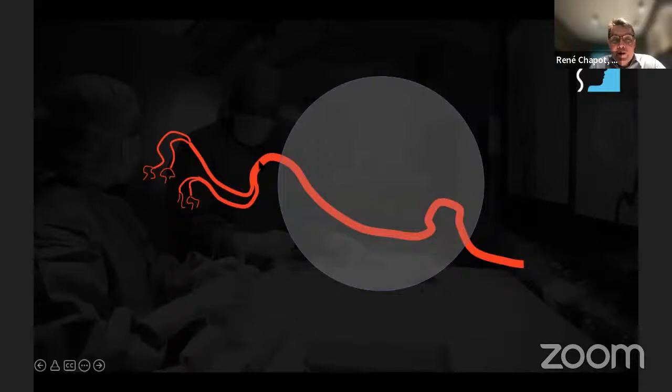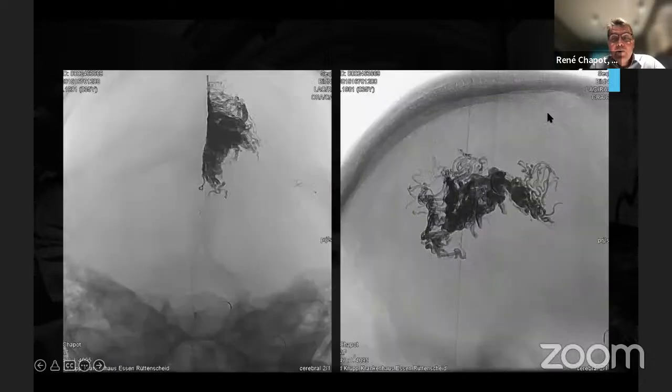But if you search for this, and once you get to this point here, then you just trap the artery, meaning you bring another catheter. With catheter number 1, you occlude with coils on both sides. Catheter number 2 is left inside to occlude all the shunts simultaneously. Here's some additional glue to avoid any more reflux.